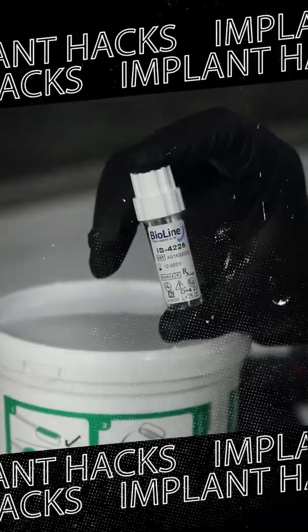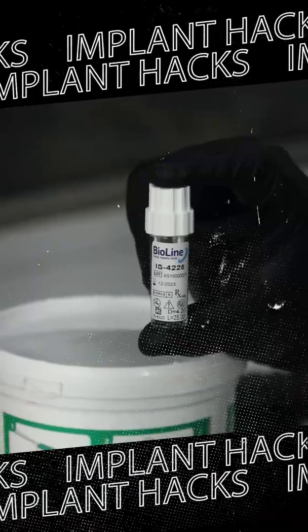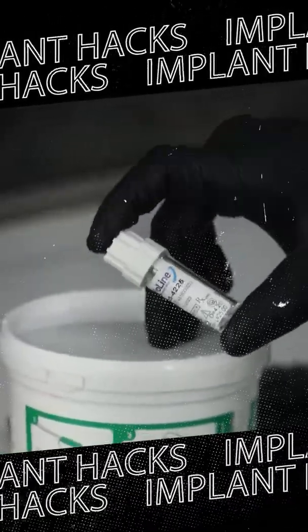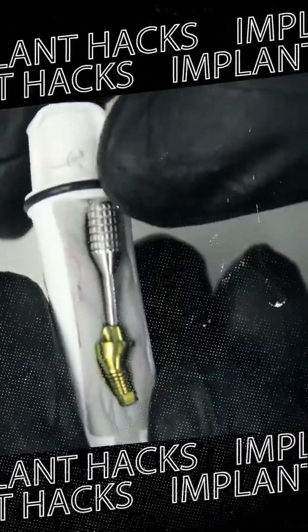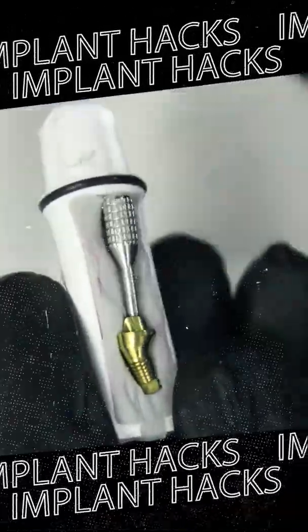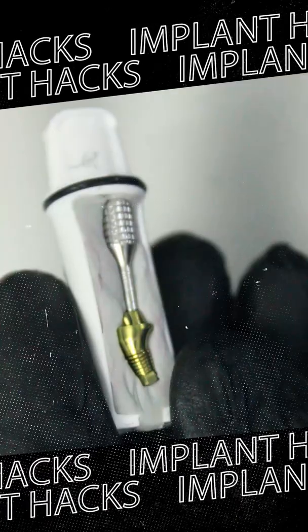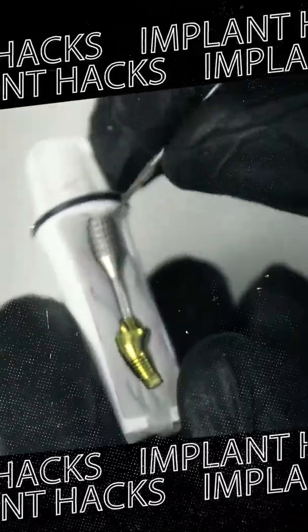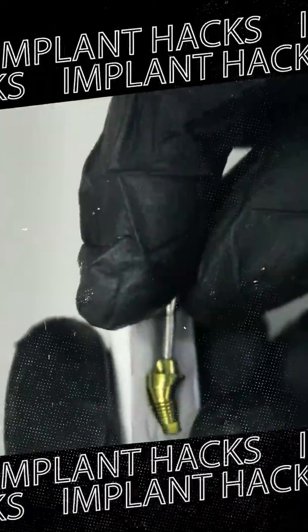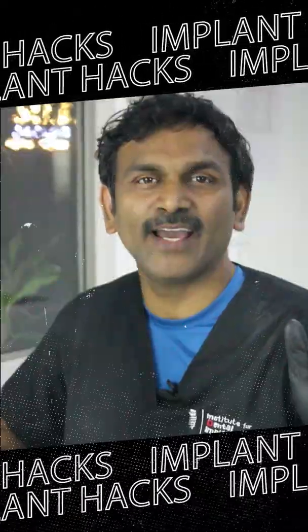We just need two things: one is the empty implant box, and the second is the putty material. Mix the putty material and make the mold of the abutment of any angle which you want. You can make any kind of customized molds — it could be of various heights or various angles, whichever you want. More hacks in this space.